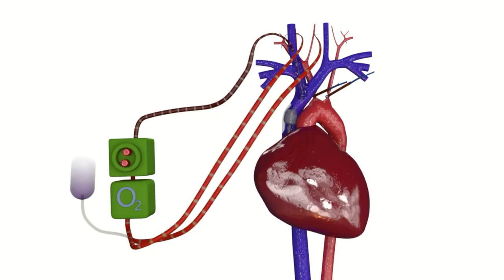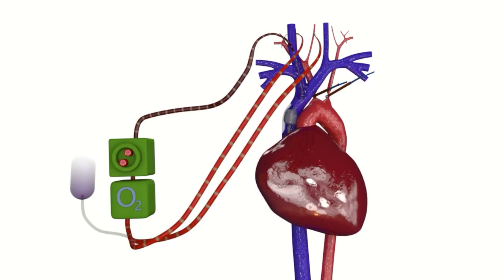Finally, the vascular bands on the arteries are released, the balloon catheter in the superior vena cava is deflated, and all vascular cannulas and catheters are removed. Heparin is neutralized using a protamine solution under coagulation monitoring.